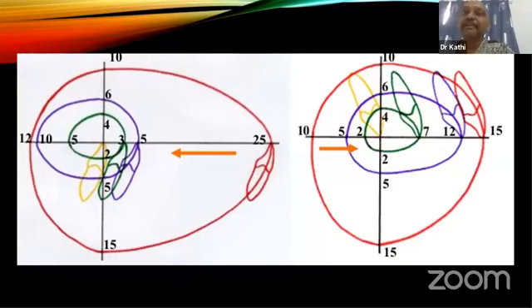skeletal discrepancy. You see the small green envelope here, the small green envelope here, and the small green envelope here. This is in the upper arch, this is in the lower arch. So this 7 shows the amount of distalization of the upper incisor in orthodontics alone using braces, the green circle, is only 7 millimeters. So imagine this, if the patient has more than 7 millimeters, you are already pushing the boundaries of orthodontics.